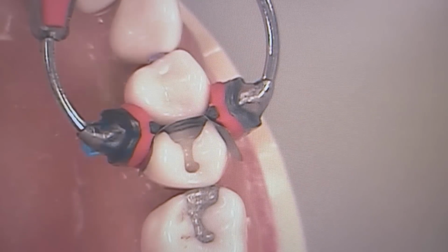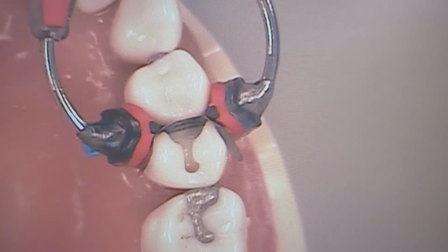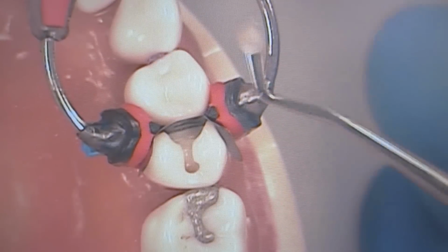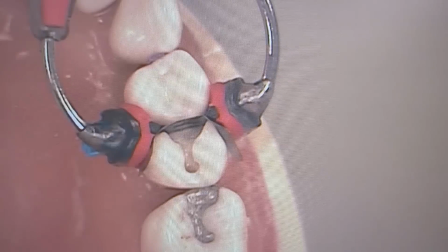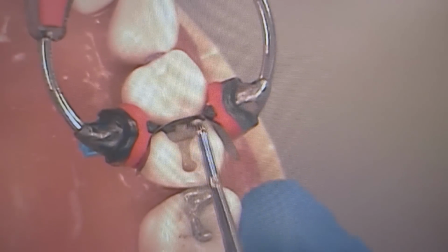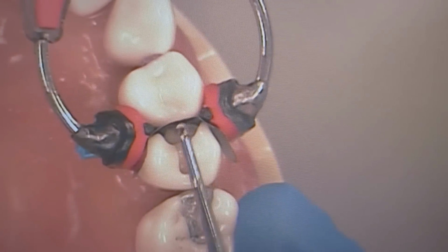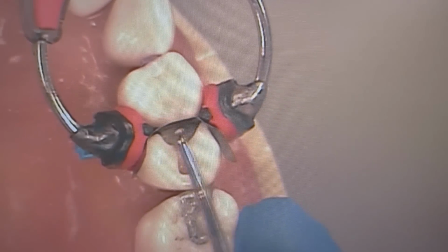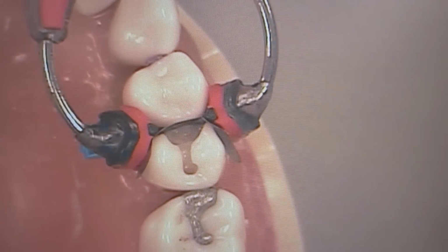Is this applying the composite now? He just placed it on his hand, a little bit on his hand, in the anatomical snuff box. Now he's taking composite on the composite tool, just a little bit, maybe a little ball, on the round packing end. Putting it into the preparation, tapping it with light placing taps into the box form.